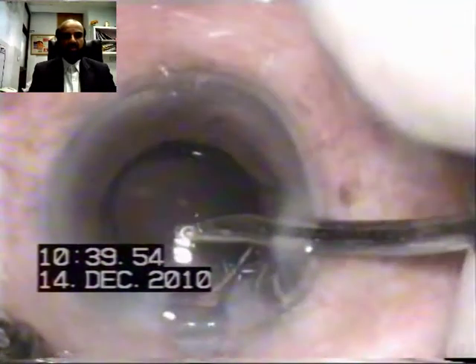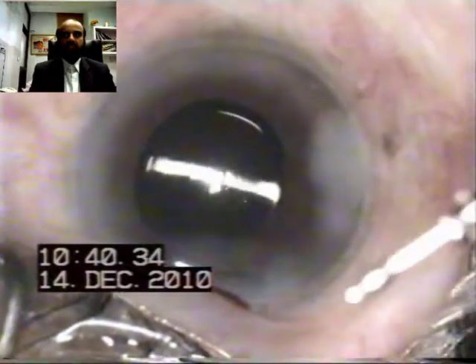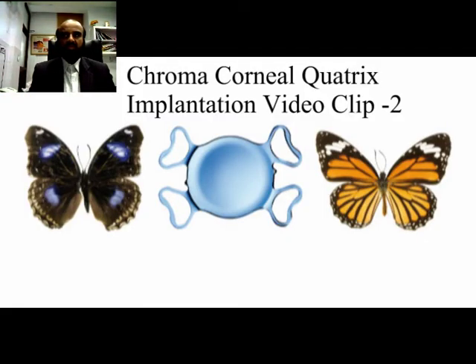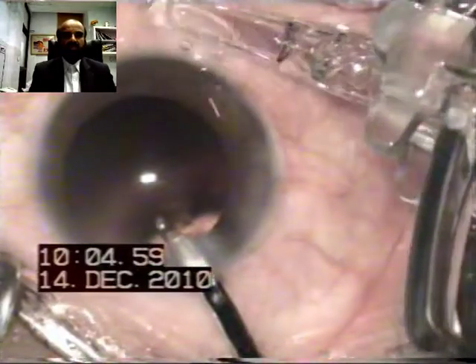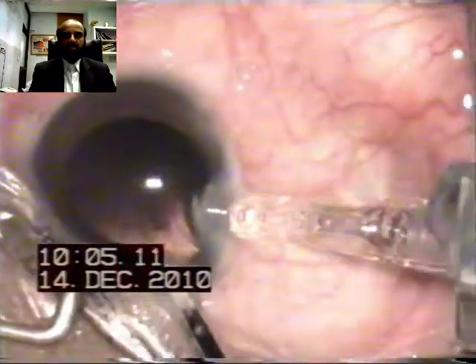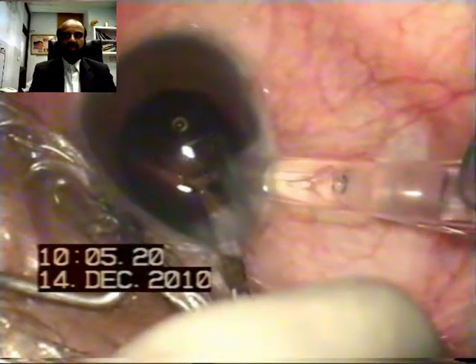Once the IOL is delivered, the rest of the placement of the haptics can be very easily undertaken with the help of the same irrigation aspiration cannula. The wound is hydrated. In another video clip, the same procedure is demonstrated: the irrigation aspiration line is through the paracentesis maintaining the anterior chamber, while the other hand manages the IOL injection system placed on the lip of the wound, and by engaging the cartridge into the incision, the IOL is injected pointing towards the posterior capsule.